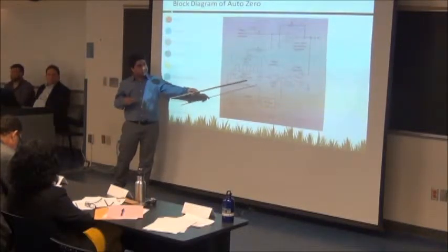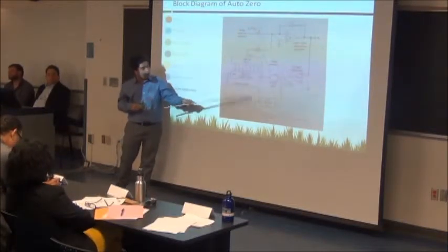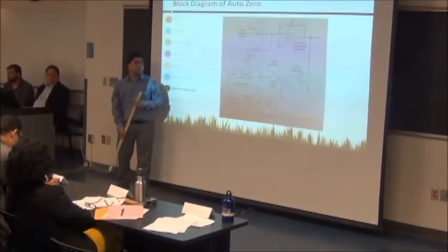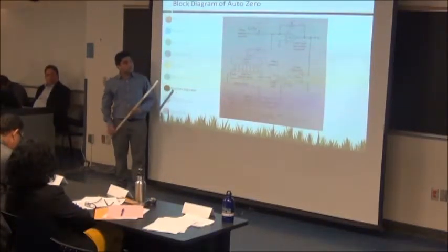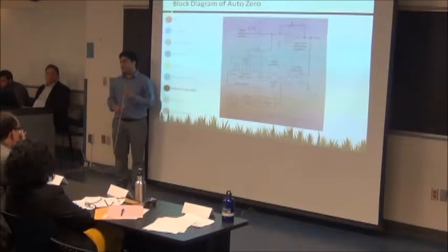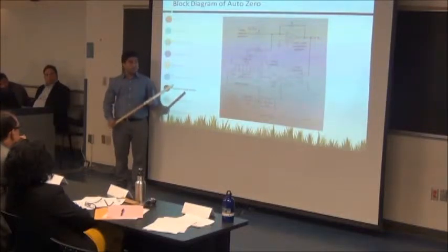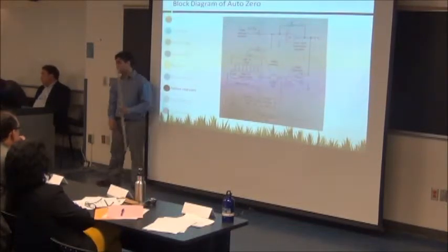So this comparator will detect the zero and stop the whole cycle of running digital to analog conversion, and the pressure signal will flow statically at the output of the machine continuously, unless we open the stopcock to atmosphere, then it's going to change its static level again, and again we have to press zero and zero down that atmospheric pressure.